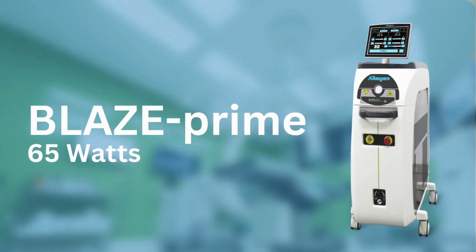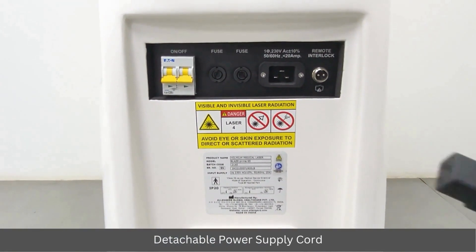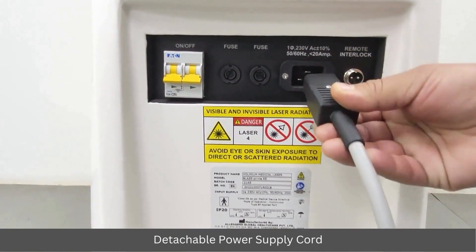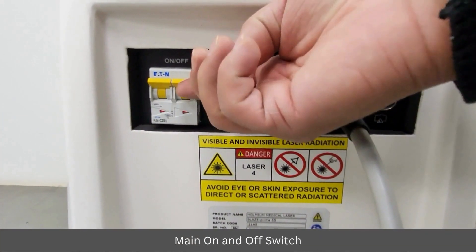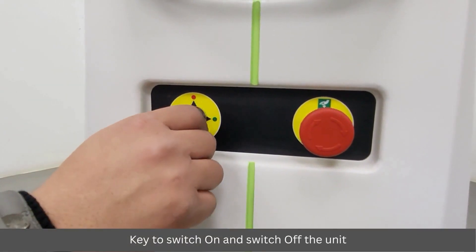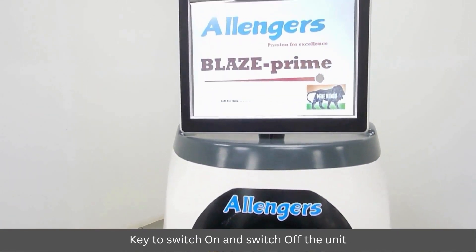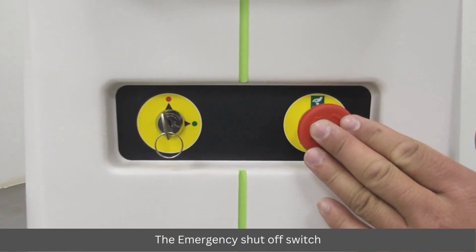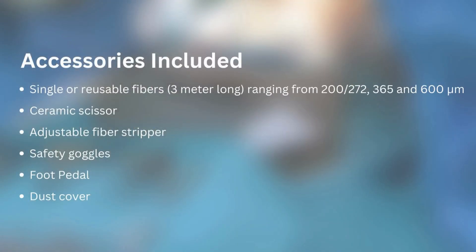Other useful features of the Blaze Prime 65 watt: detachable power supply cord, main on/off switch, key to switch the unit on and off, and emergency shutoff switch. Accessories included: single-use or reusable fibers, ceramic scissor, adjustable fiber stripper, safety goggles, foot pedal, and dust cover.